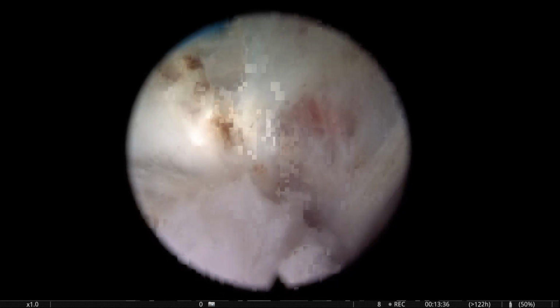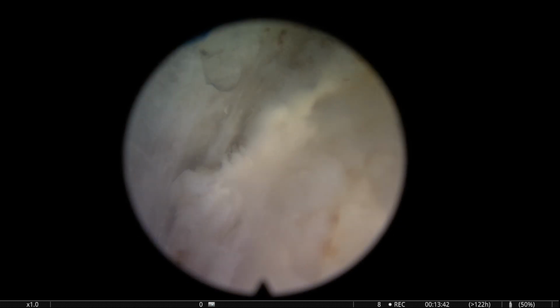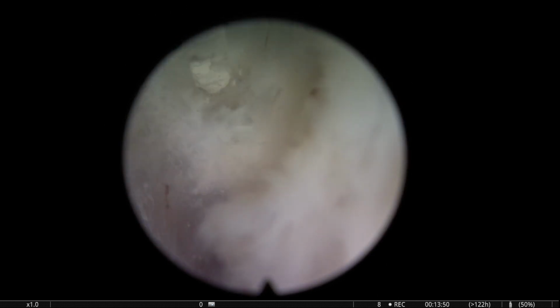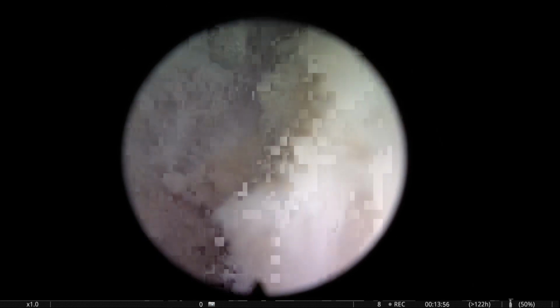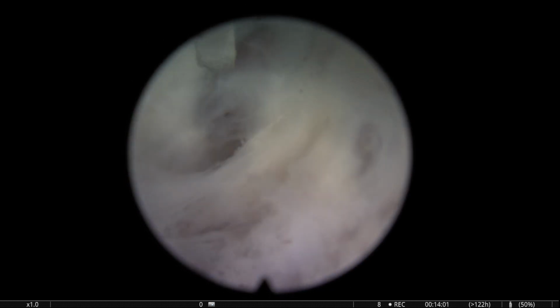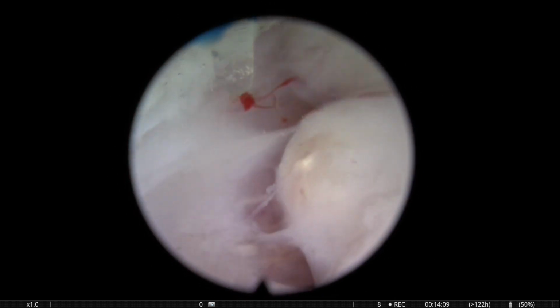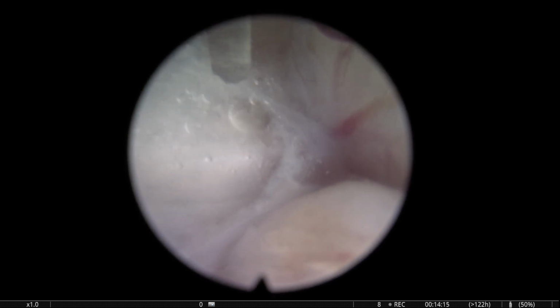But as I was saying, we know the features of the capsular plane, but we also have to have some other information. For example, when you see a photogram, you don't recognize what is capsule and adenoma. Luckily, we have memory, and we remember the previous photograms, and of course, that can help, you know, getting the idea of how the plane is going. We can predict how the lines are going to go, more or less.